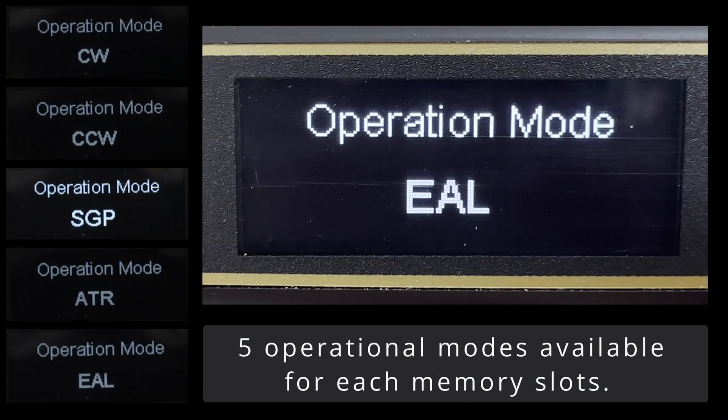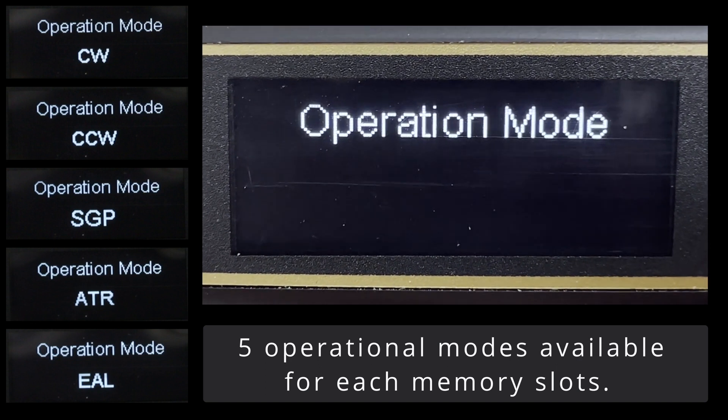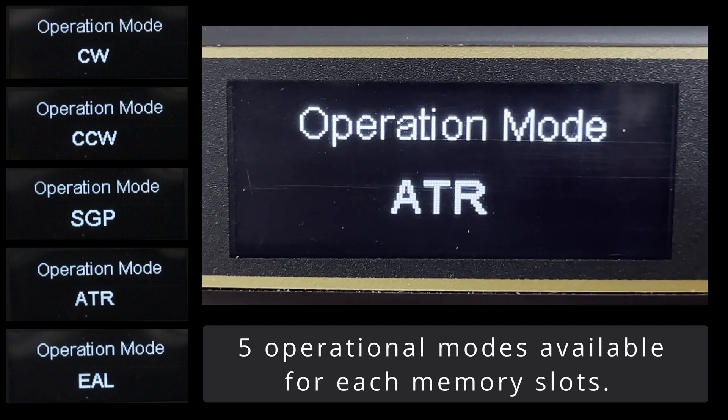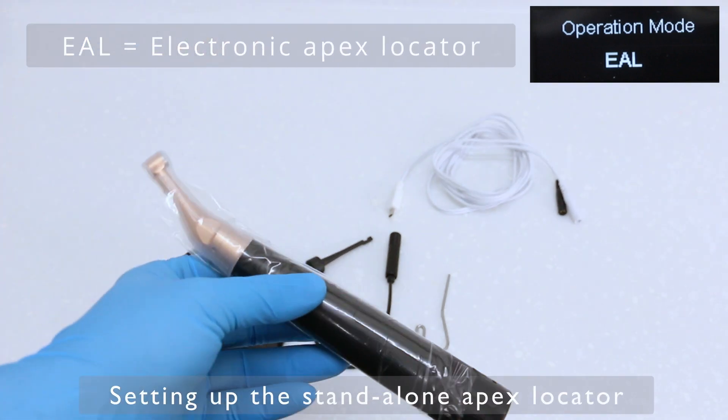Starting with the 10 programmable slots, there are five operational modes that can be selected: clockwise, counterclockwise, SGP (which is essentially reciprocating), ATR (a safety mode for rotary files), and a standalone electronic Apex Locator.